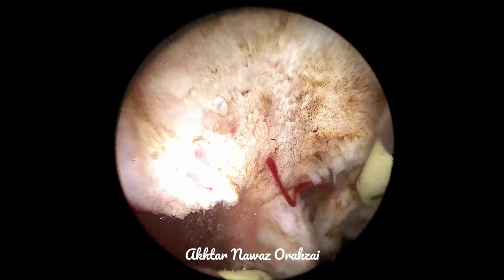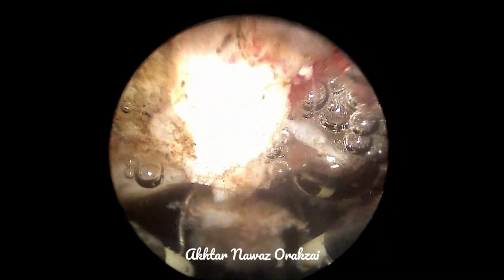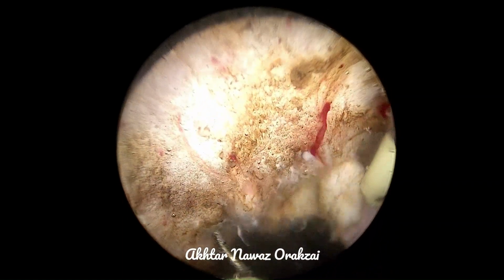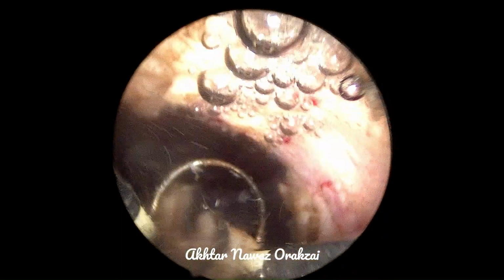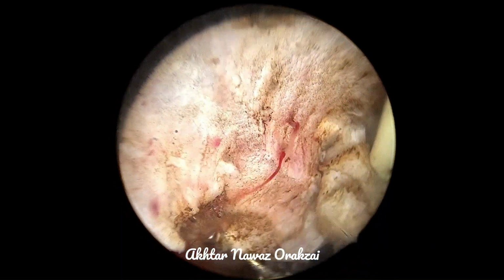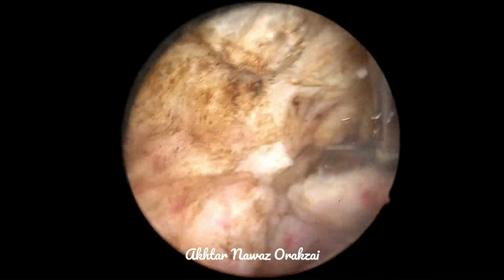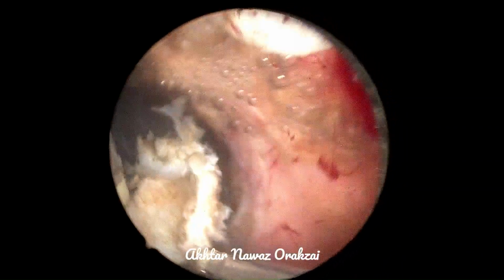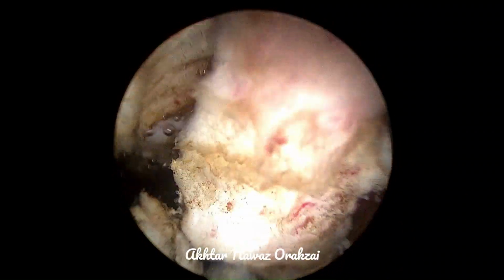At no point during the procedure must one use the diathermy if the verumontanum is in the vision. If the verumontanum is in the vision and you are using diathermy, it means that the heat of the diathermy or electrocautery may reach the urethra distally. So strictures of the bulbar urethra are more common in such conditions.